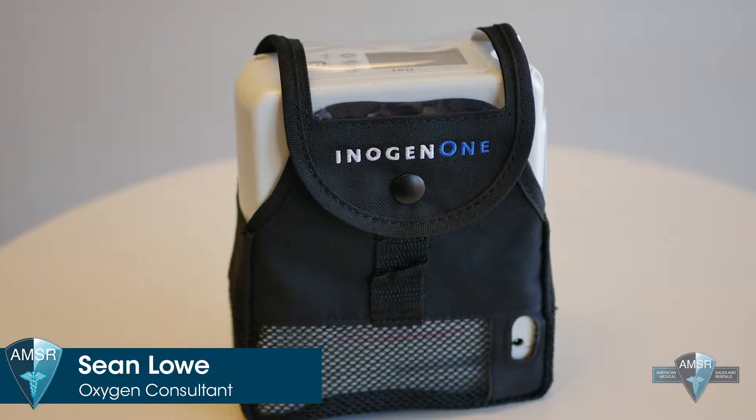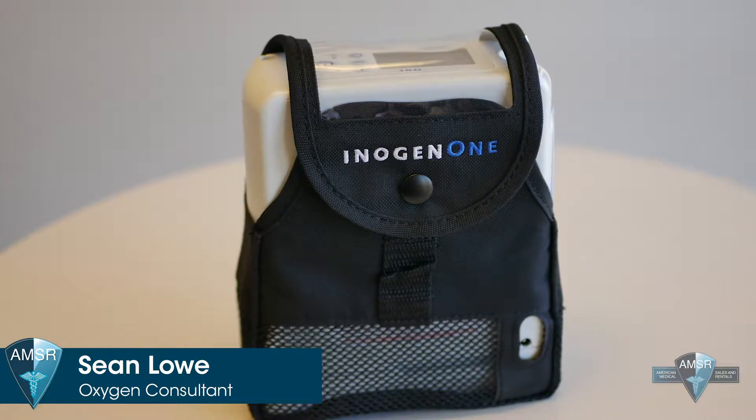Hello everybody, my name is Sean. I'm with the Oxygen Concentrator Store by American Medical. Today we're going to talk about the Inogen G4 portable concentrator. It's the smallest portable unit on the market that goes up to three on a pulse setting.